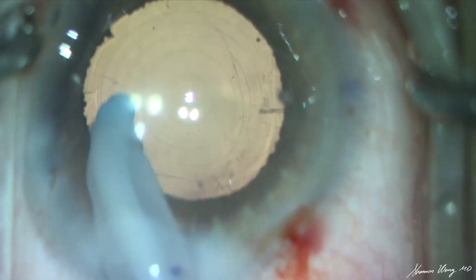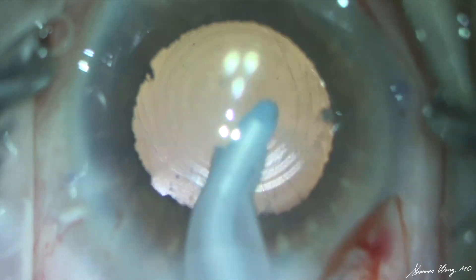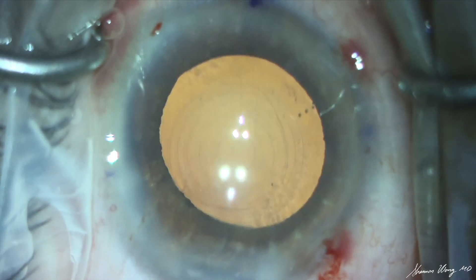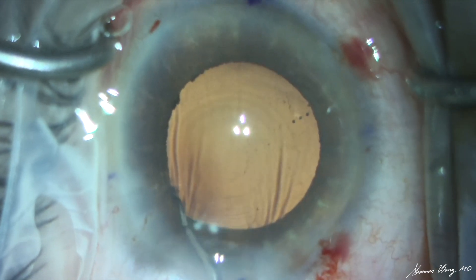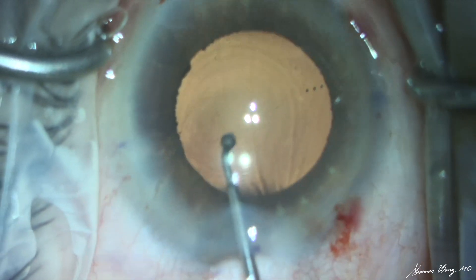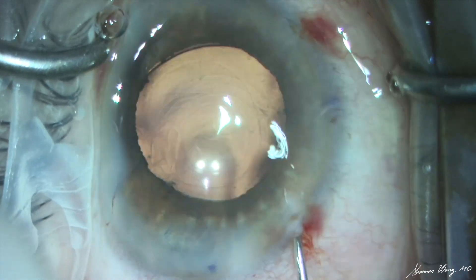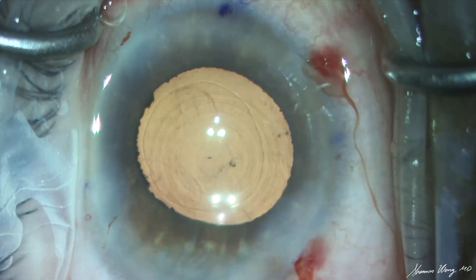Initially we try to rotate the IOL into correct alignment with the I/A tip, but then realize this technique will likely cause unwanted stress on the zonules. Ultimately we use Healon Pro viscoelastic in the anterior chamber and micro instruments instead of the I/A tip to gently rotate the PanOptix Toric into correct alignment. Once in proper alignment, instead of removing the viscoelastic with the I/A, we flush the Healon Pro from the eye with BSS through a 27-gauge cannula.